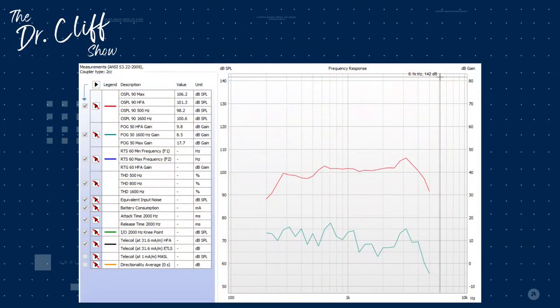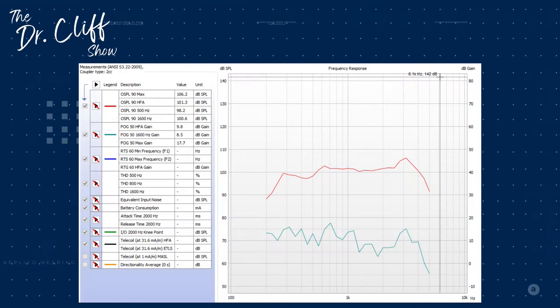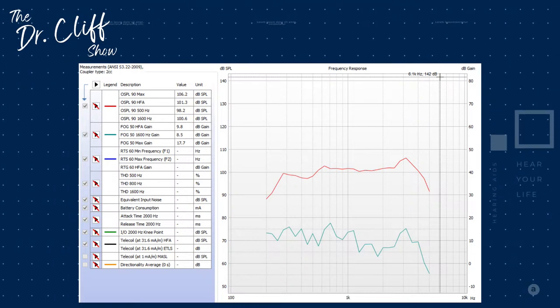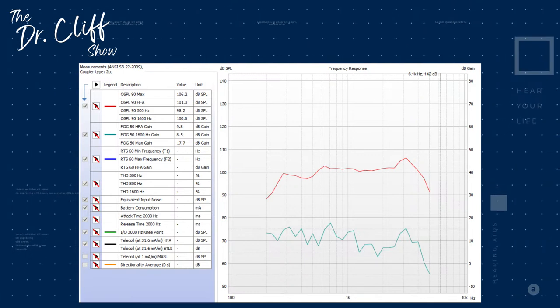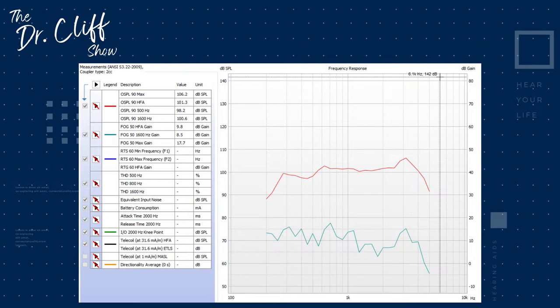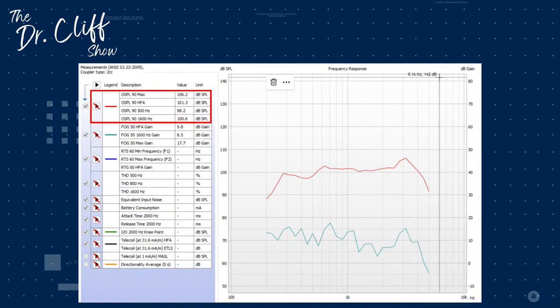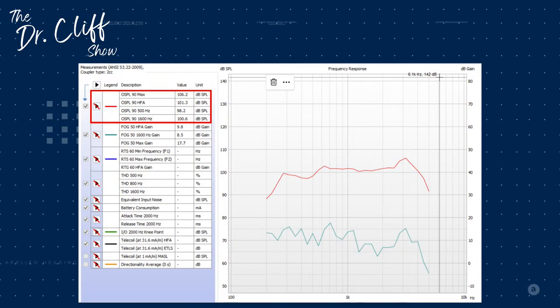So you can tell by the images on the right-hand side of the screen that those curves are substantially lower on this graph than what they were otherwise. But over on the left-hand side here for the OSPL 90 max, that came out to a score of 106.2. And for this particular hearing aid, we were well below what the tolerance range was for the output of the devices. And typically, depending on the type of receiver that someone uses inside of their ear, these numbers are generally going to be up in the hundreds.